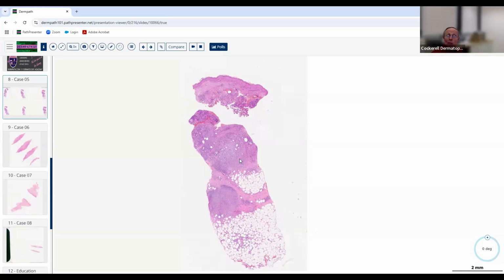Now, what kind of inflammatory cells are present? Mostly neutrophils. Do you think most of these are neutrophils? There are going to be some in there, I'm willing to bet. But what do you know? Maybe. It looks pretty light at low power. Yes, good, very good. They look pale, light. So what does that make you think about?